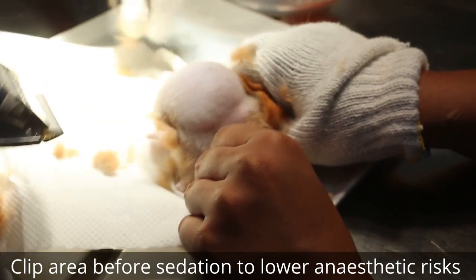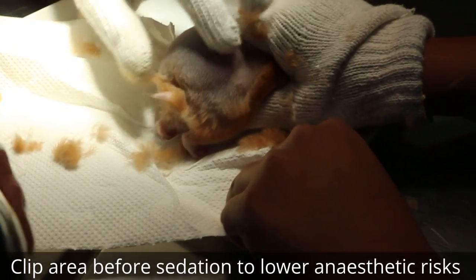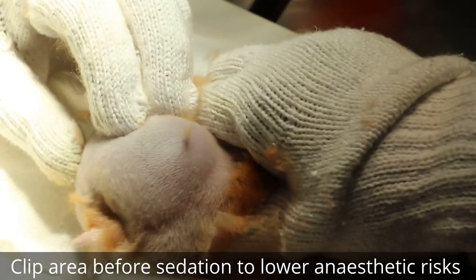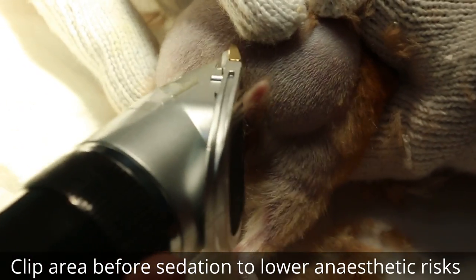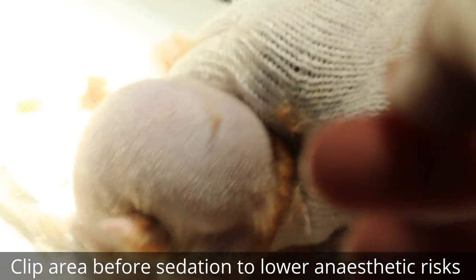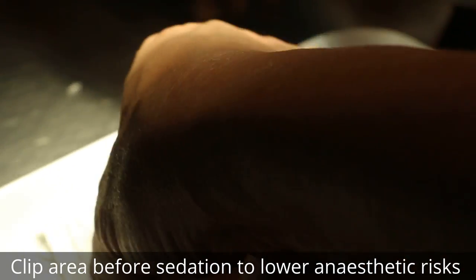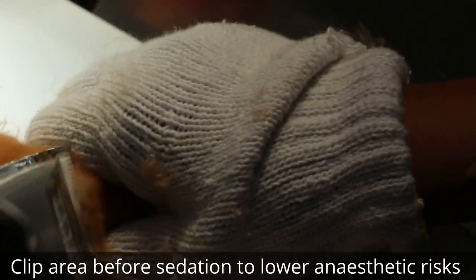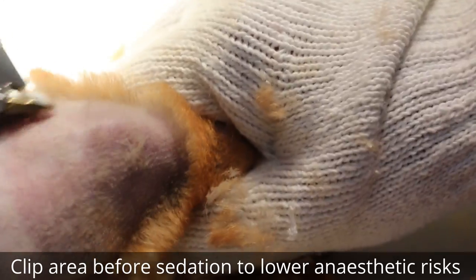It looks very much like an abscess or hematoma or cyst. But we still need to shave off first. Then you will take a needle and aspirate. The second step. First step, clip first for surgery. In front also. We'll take a look at this. The front here. Correct, okay, that's good.